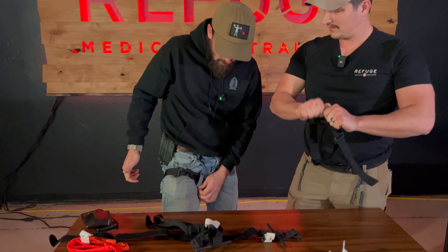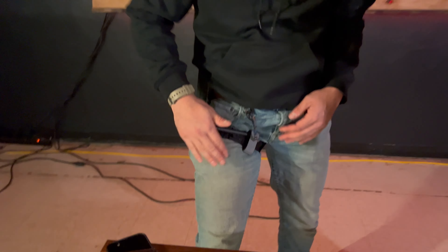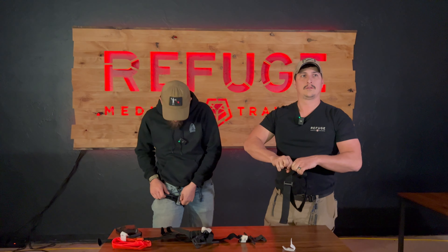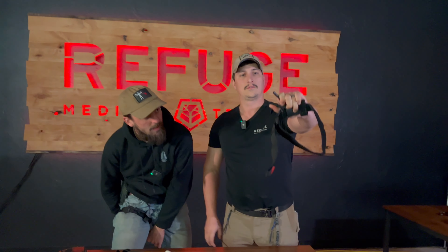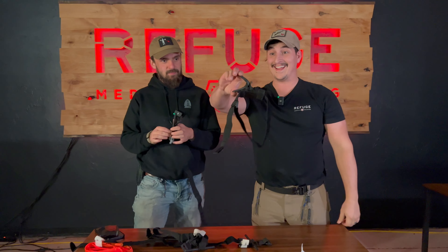Why does this matter? You don't need to fight a crappy windlass when you're trying to put a tourniquet on. With a CAT Gen 7, I can work it in one turn — no bending in the windlass, easy security. It's good to go.